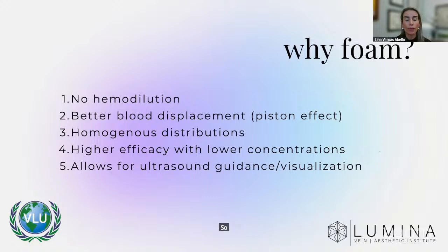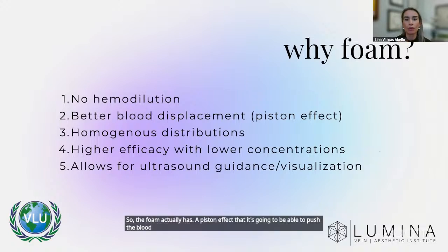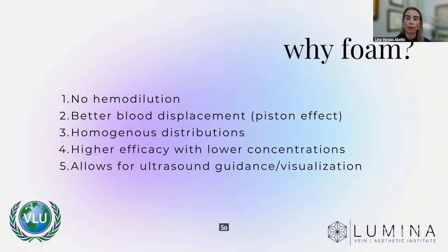So the foam actually has a piston effect, where it's able to push the blood and really displace it. That's what we want. We want to displace the blood. So those micro bubbles come in contact with all of that endothelium and lead to the damage that we need to achieve. It's going to be distributed in a more homogeneous way.